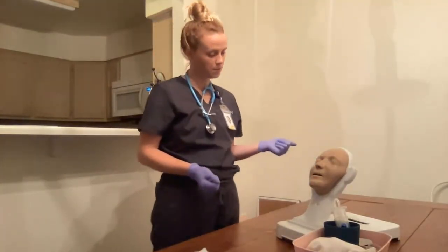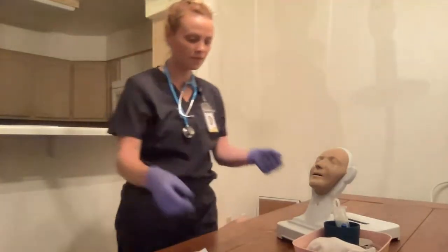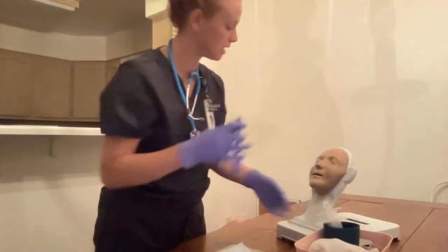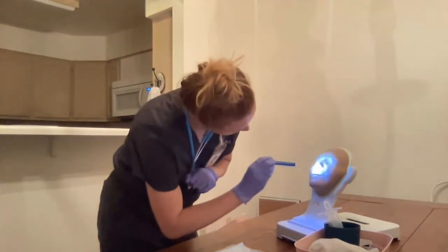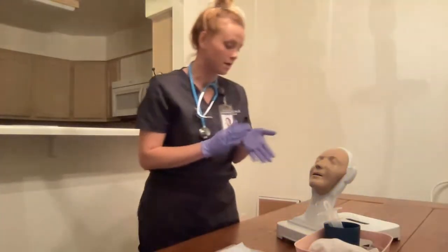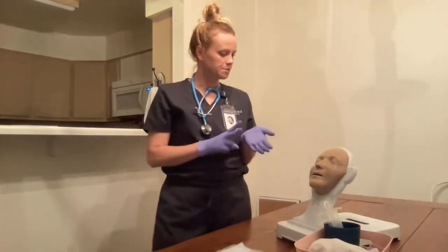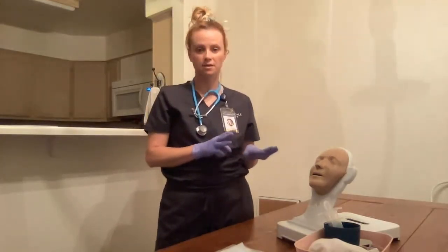Alright, are you comfortable how you are? Good. I'm also going to raise the bed just slightly. Alright, Mrs. Smith, next I'm going to take a look at your nose, okay? I'm going to shine a light in your nose. Alright, good. My patient's nares appear patent. There's no occlusions, no abrasions, no deformities, anything like that.